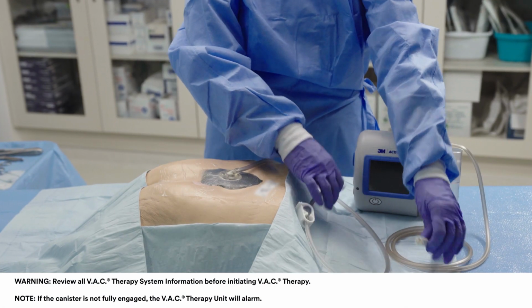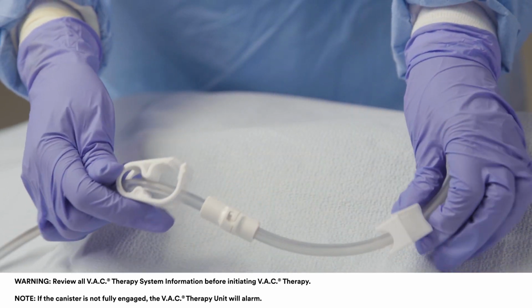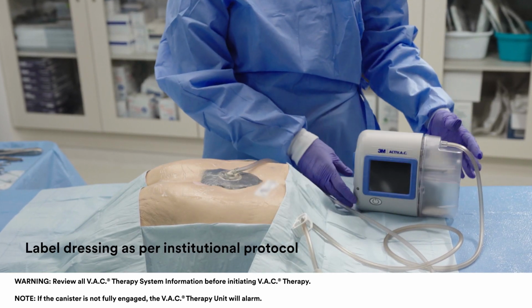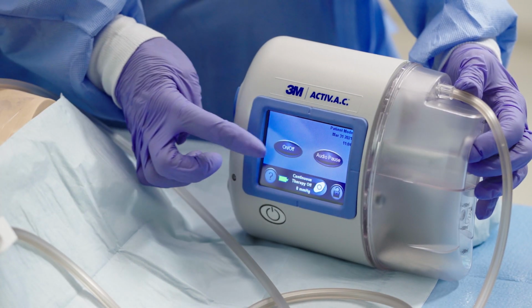Connect SensorTrack pad tubing to canister tubing and ensure clamp on each tube is open. Position clamps away from the patient. Turn on power to the VAC therapy unit. Select prescribed therapy setting.